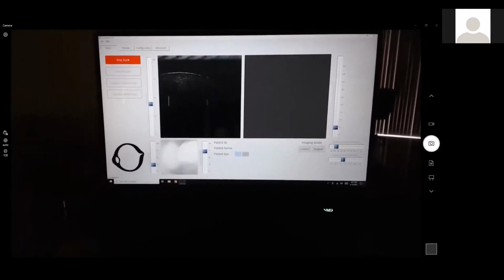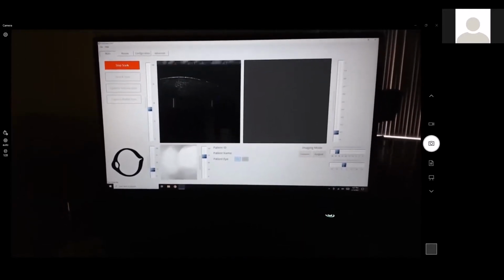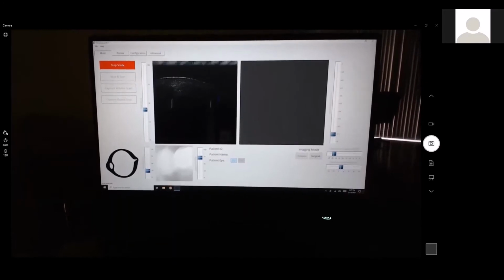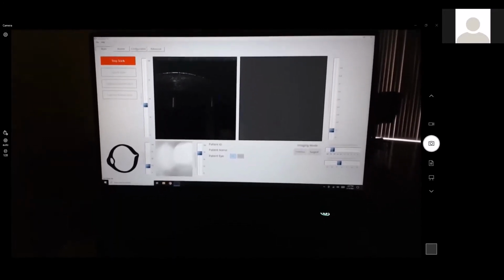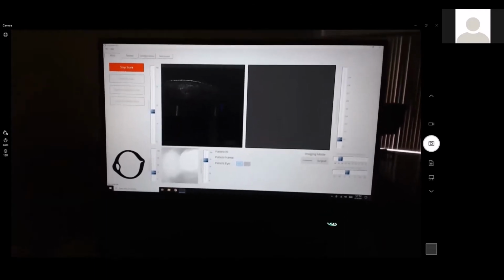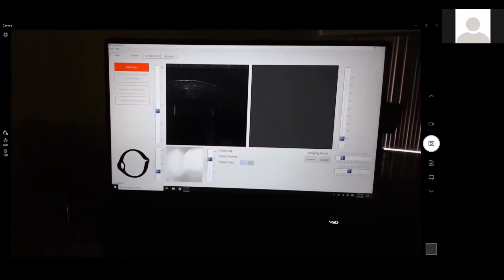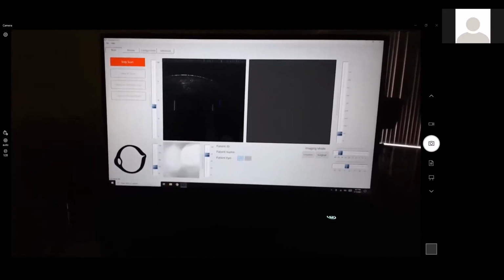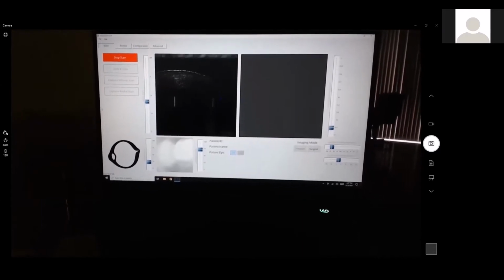Now what you can see is starting to go layer by layer through the cornea. And this was actually very nice and stable data. So I suspect we could render this later on, not today, but with a little bit of time, we could rebuild that 3D of this cornea, because this is very nice, stable animal data. This is really very good. And this is clearly showing the benefit of doing sedated, seeing how stable everything's going.